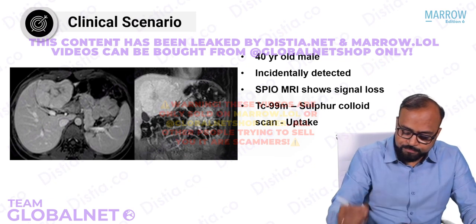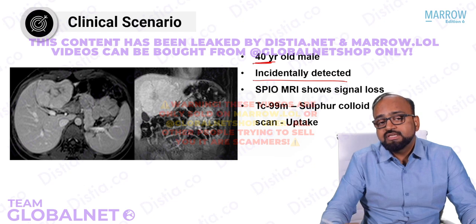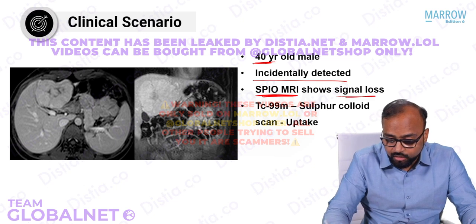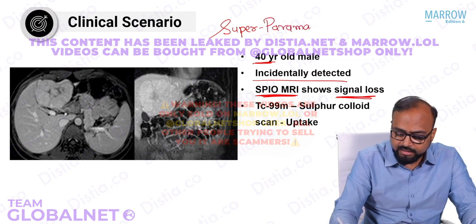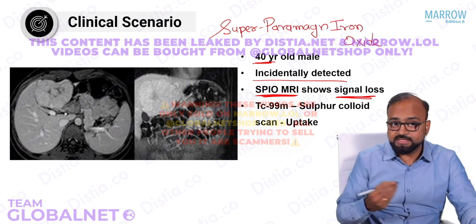Yes, now look at this lesion. A 40-year-old male presents with an incidentally detected lesion, but the examiner gives you a clue. What is that clue? An SPIO MRI shows signal loss. This is called superparamagnetic iron oxide MRI. This is a specific application.